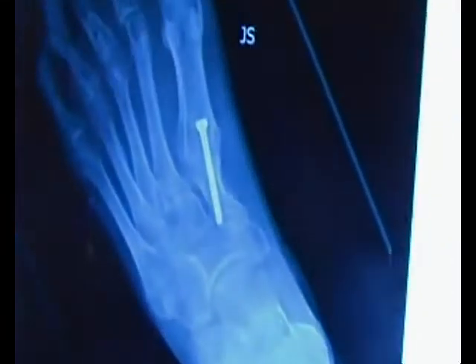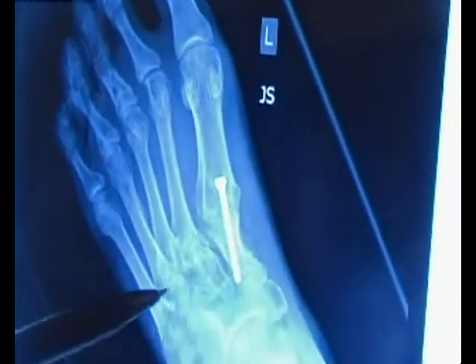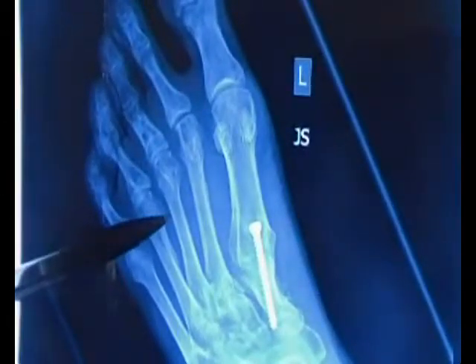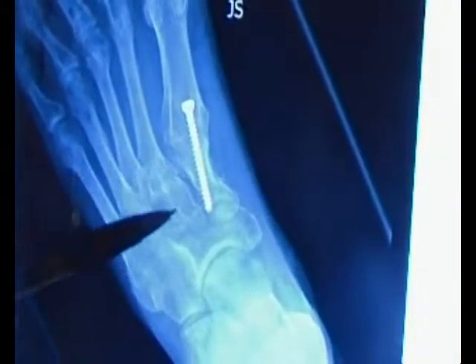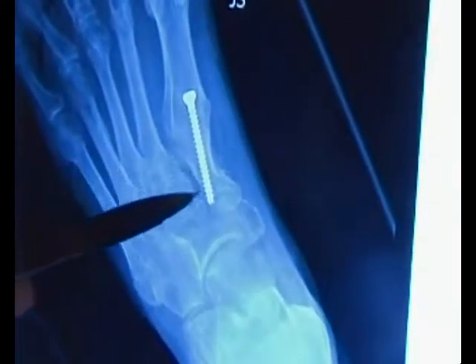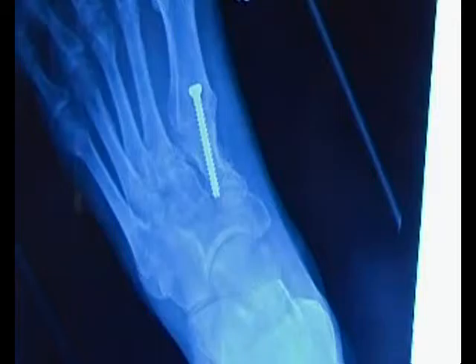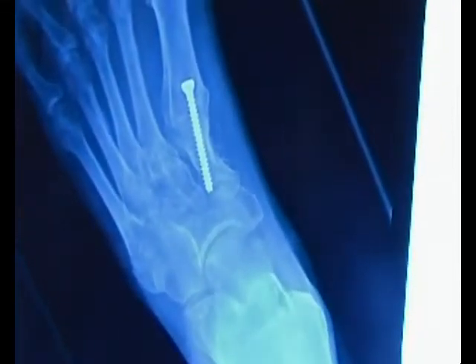Involved in a high-velocity car accident, he injured his foot. You can see there have been previous fractures up here — he tells me he had wires down here. More importantly, look at the midfoot. He's had a Lisfranc's injury, and he's had a fusion here. Do you know what a Lisfranc's injury is of the midfoot?